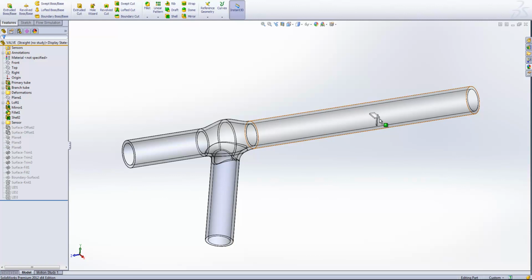But in this case, what we want is for the fluids to be completely mixed at that location, so that the sensor is getting an accurate reading of the mass fractions of the ethanol and the water. And then the fluid is just going to continue out to atmospheric pressure at the outlet. So let's jump in and have a look at setting up our study.